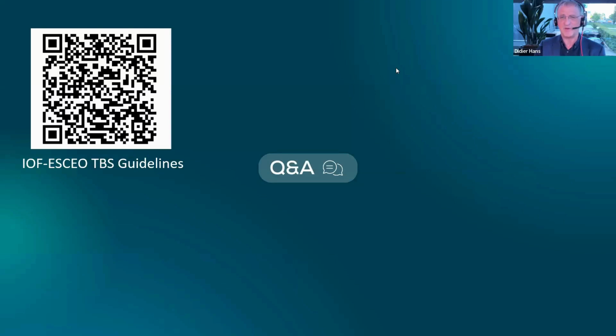We have another question from Alexandra Rodriguez. Maybe the rheumatologist office owns the DEXA and they are reading. So that's for you, Lauren, as a follow-up. Yeah, so if the rheumatology office owns the equipment and is doing the reading, they would bill the global code for both the technical and the professional component. Yeah, so we're good.